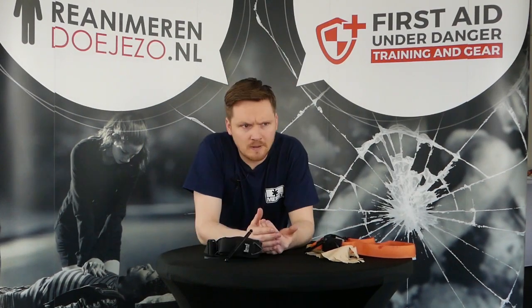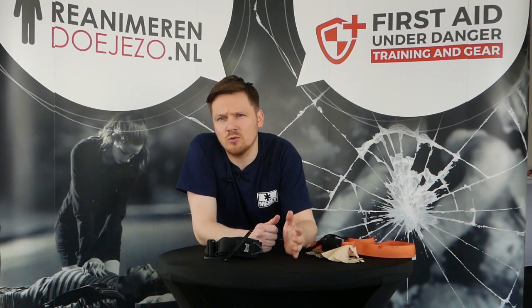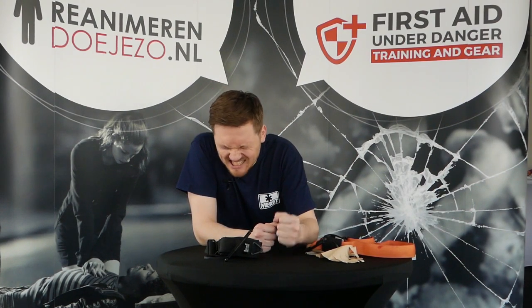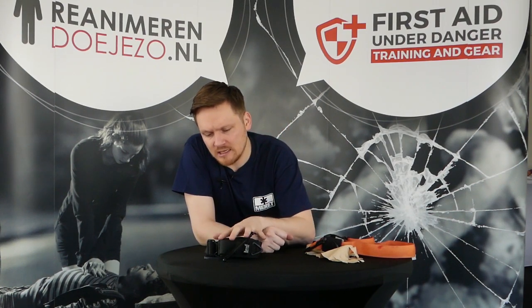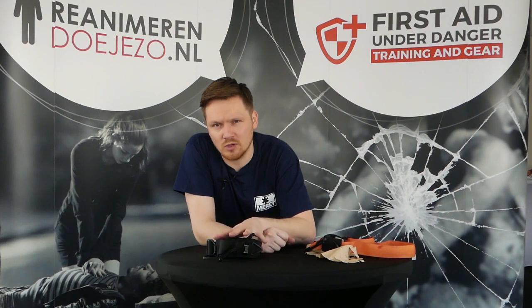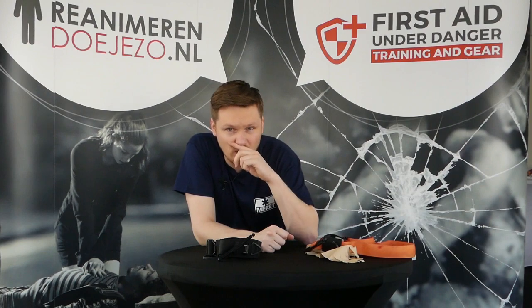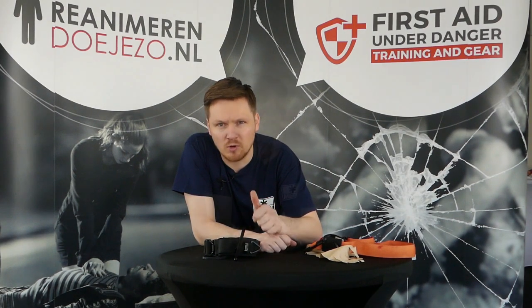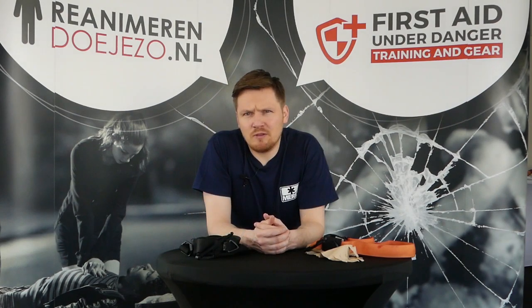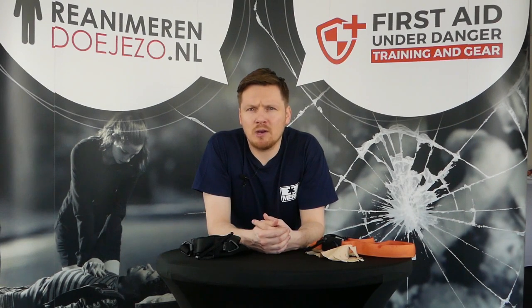In comparison with the Combat Application Tourniquet, it's easier to get it high and as tight as possible. And I must say that it still isn't as easy with the SOF Tourniquet 4, but I do believe that because of the buckle, and if you're trained well enough, this could be a better tourniquet suitable for you because it's much stronger. I do believe that the SOF Tourniquet is much better than it was. Is it as good as the Combat Application Tourniquet? Yes, in some instances it is.